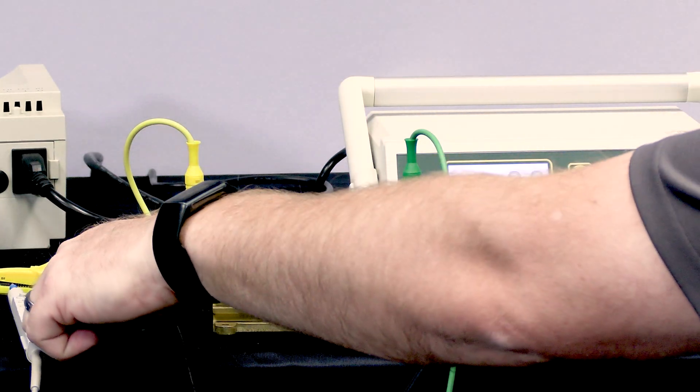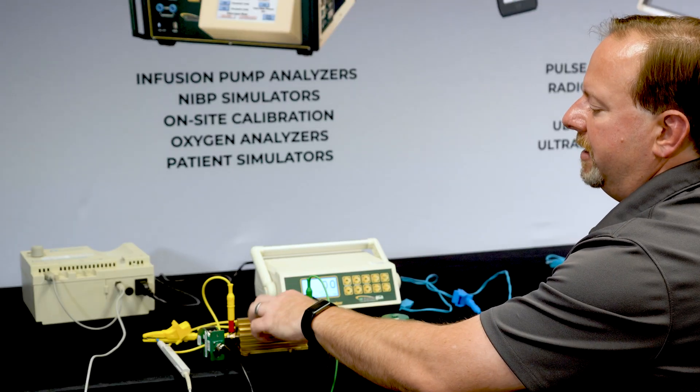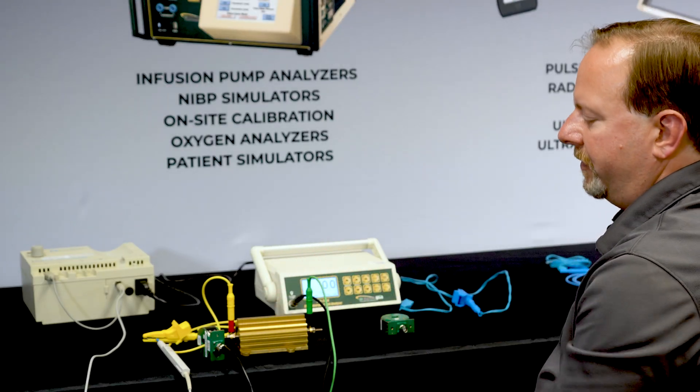The path goes from the scalpel through the current transformer to the test load—this is our patient—through the table back to earth ground.